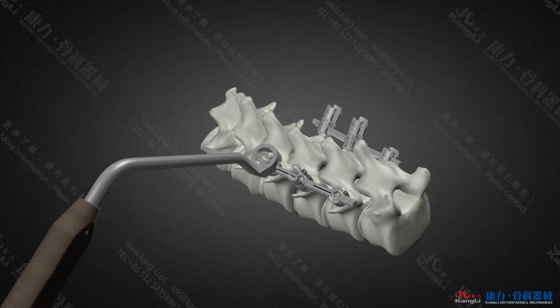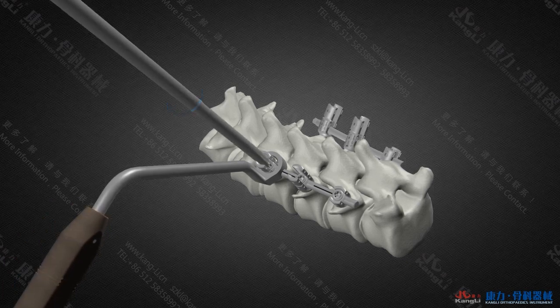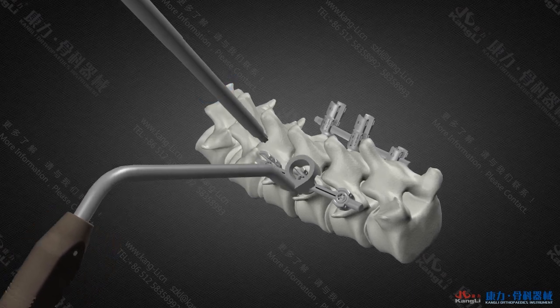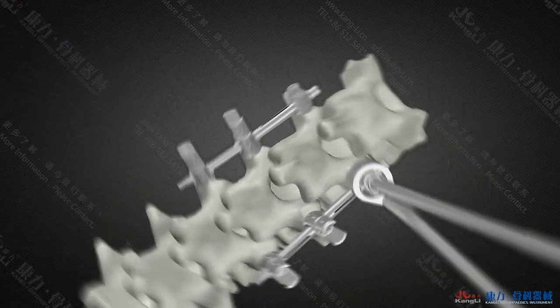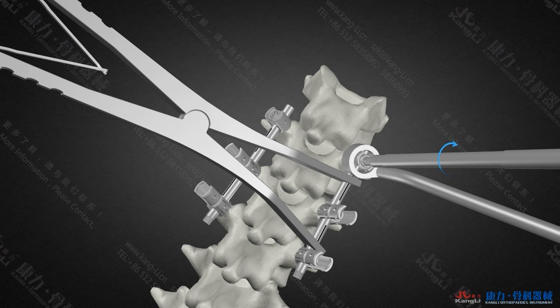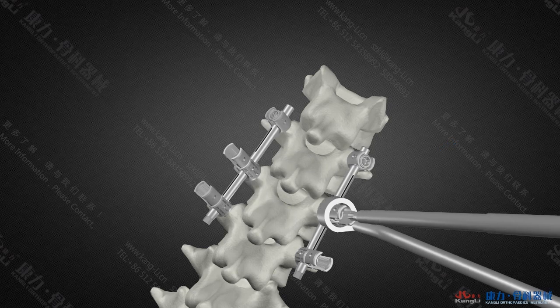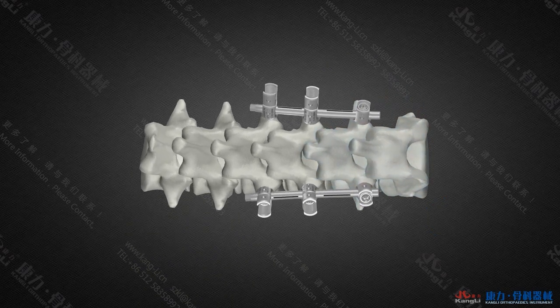Operation demonstration of stretch fixation. Use the T5.3 wrench and anti-rotation device to fix the plug screw on one side, while the plug screw on the other side is loosened. Place the stretch clamp. Stretch slowly to the proper state, then wrench the loosened plug screw and finish the stretch fixation. Repeat the above to finish the operation of the other side.